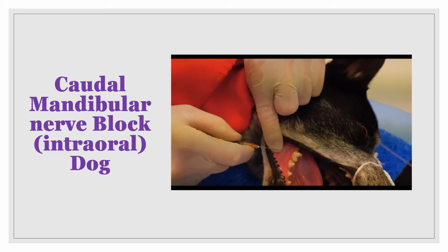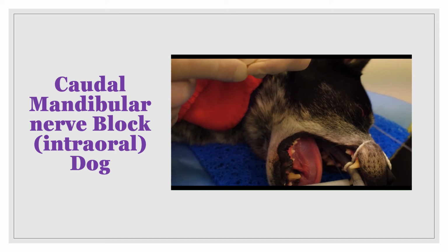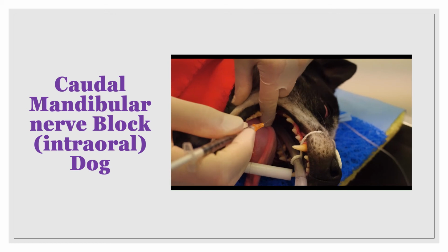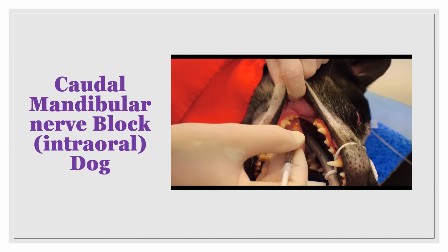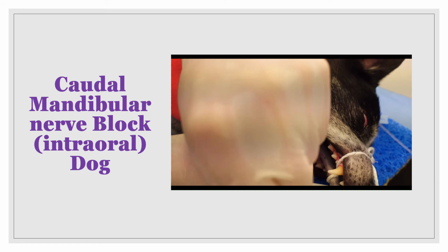So here we have a video of the caudal mandibular nerve block. We've measured the needle, the full height of the mandible. We've bent the needle at about 20 degrees. We're going behind the last molar tooth. We're walking the needle off the bone and running it along the medial side of the ramus of the mandible to where we've bent the needle. We'll draw back, make certain we're not in a blood vessel. The needle hub will be resting on the main cusp tip or at approximately 30 degrees to the body of the mandible, and then we draw back and slowly inject into that side.